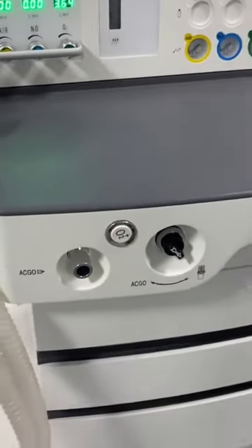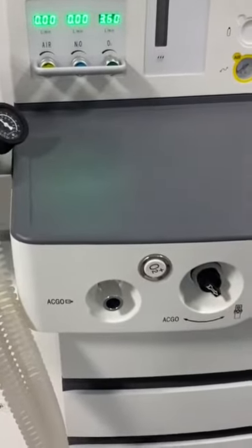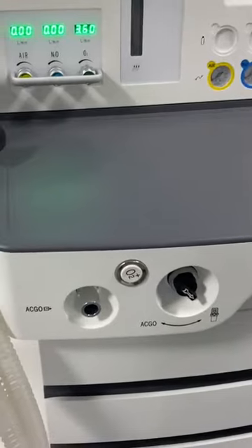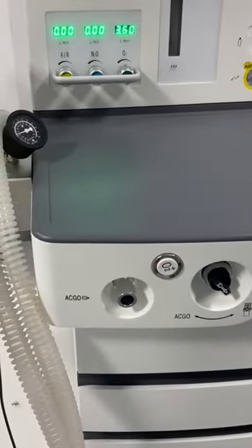And the fourth function, and the last one, also the most important, is that, as I mentioned, if the machine has no electricity and the batteries go out, so nothing can be shown here, but we are still in an operation, so now it's very dangerous.